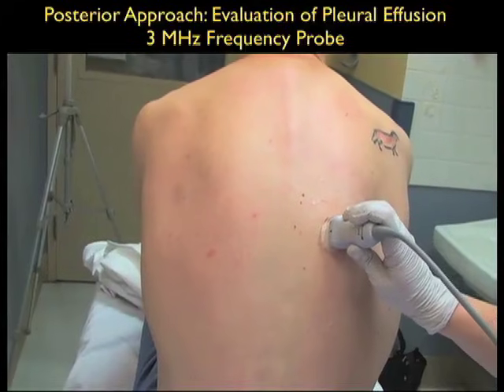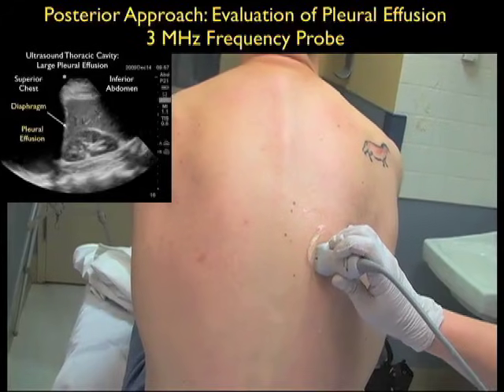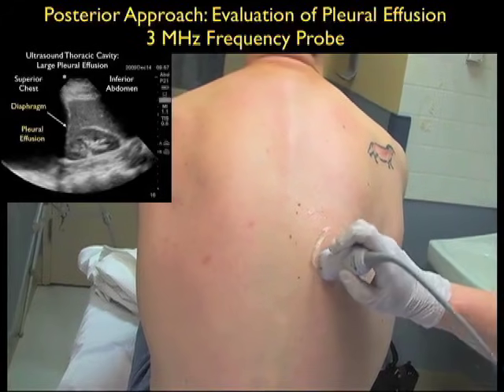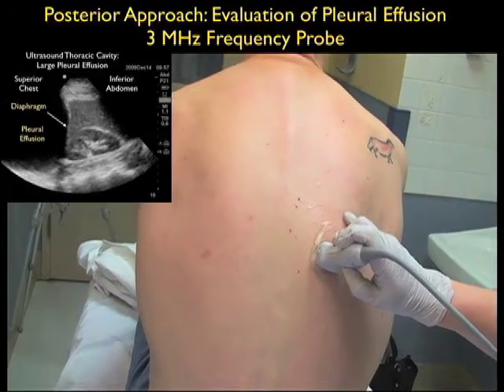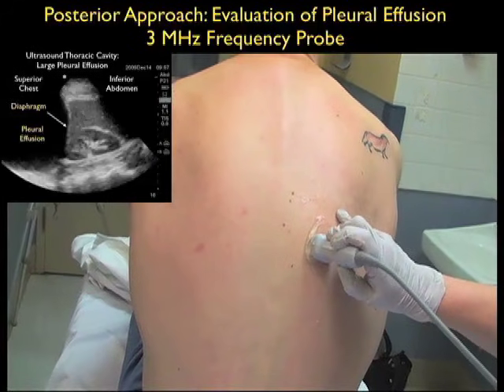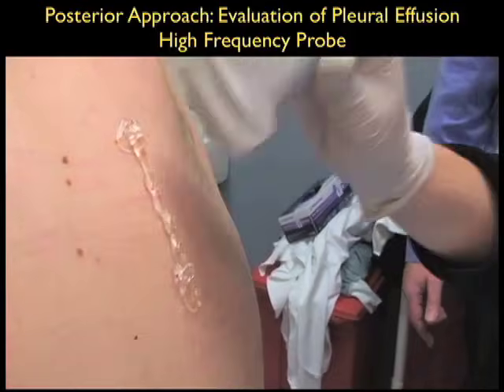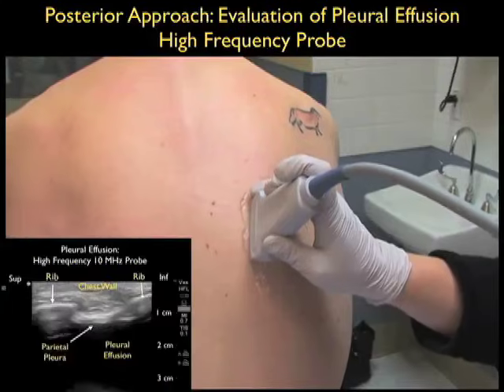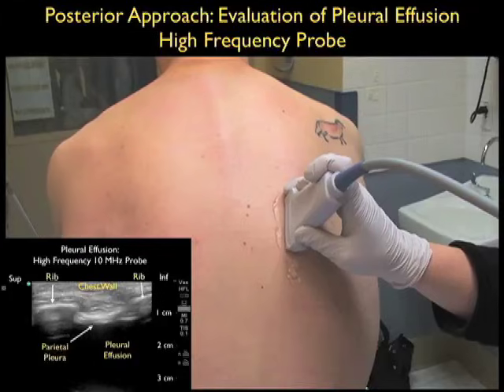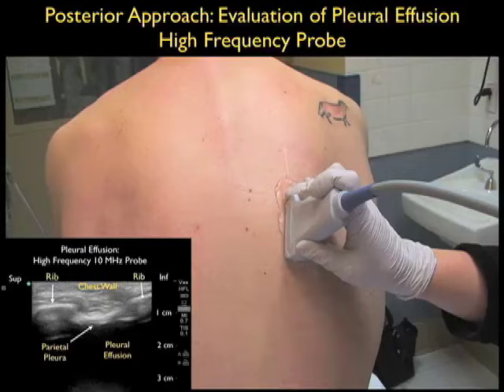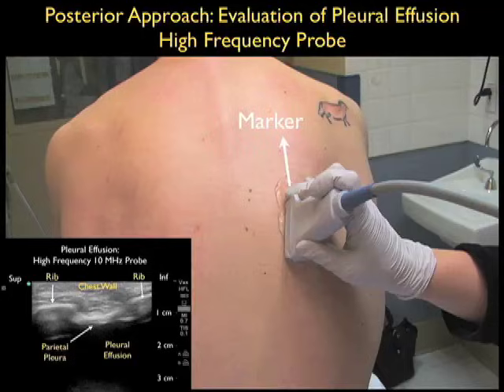Prior to the thoracentesis procedure we'll investigate the pleural effusion using a 3 megahertz probe. Notice the probe is placed along the posterior chest wall first with the probe marker in the long axis trajectory oriented towards the patient's head. We can then swivel the probe into the lateral orientation with the probe marker lateral to further investigate above the diaphragm for a suitable collection of pleural effusion. A clinical pearl is to also look with a 10 megahertz high frequency linear array probe prior to the thoracentesis puncture, placing it along the posterior chest wall in the long axis configuration, as well as oriented between the patient's ribs in the lateral orientation, to further investigate the anatomy.